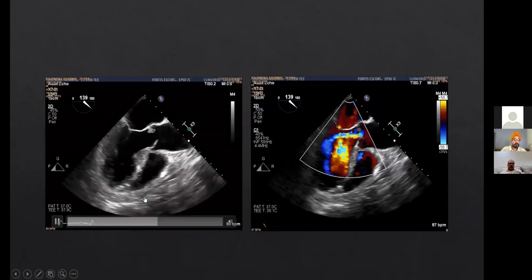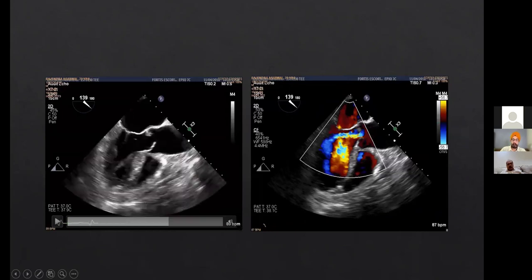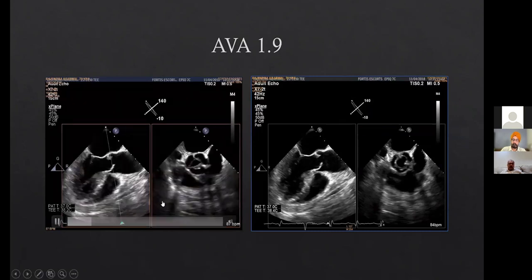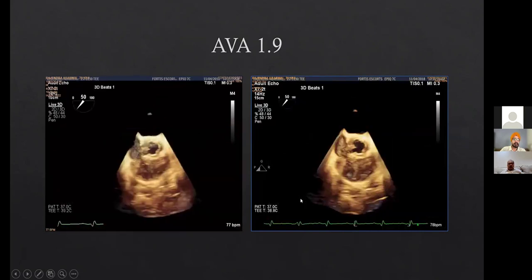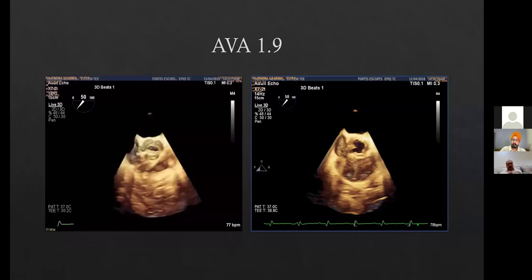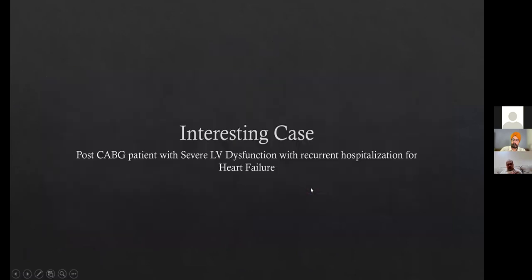So here, look at this. Here, the doming is more dramatic compared to what we were seeing. And here is a doming which you can see well. Not only that, there is an aortic regurgitation. So what we are dealing with is something which you have to figure out. So here is a stenotic aortic valve area, though the aortic valve area is not too bad, but you can utilize this as an area calculator. The advantage of 3D is that you can go right at the tip of the funnel, and you can take an axis which is right at the tip of the maximum stenosis.